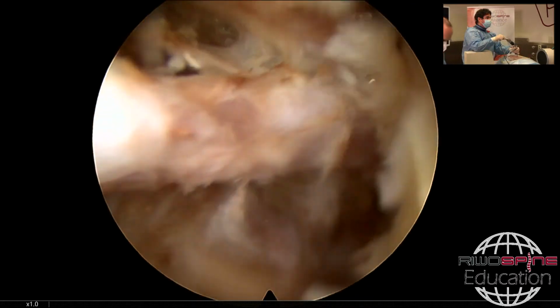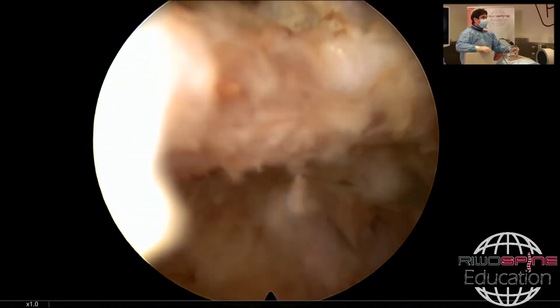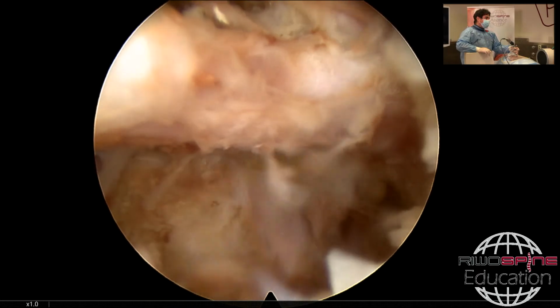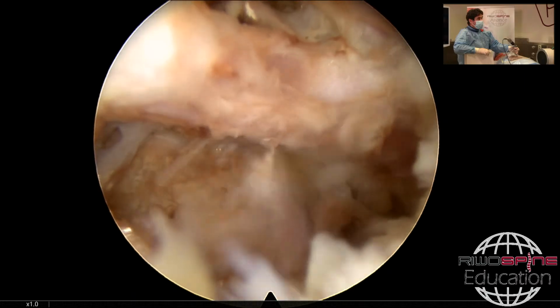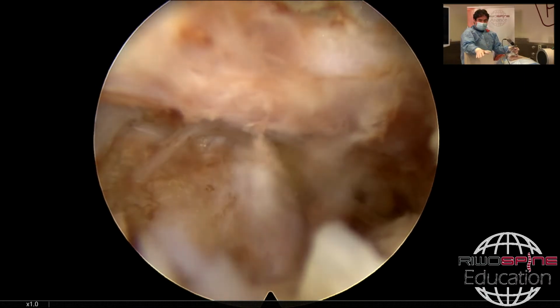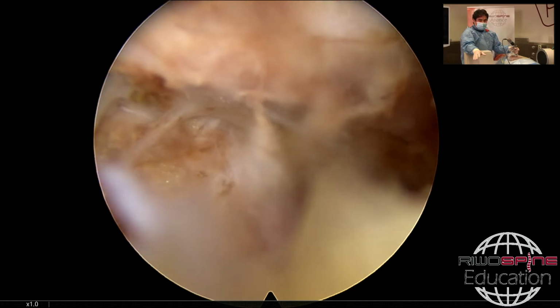Yeah. Always there's a discussion, can we reach that part with the transforaminal approach? My opinion, it's not very easy, yeah, but too many surgeons prefer to do that. To reach here with the transforaminal approach, at least you have to resect the facet joint, maybe some part of the pedicle. Rongeur, please. Yeah.